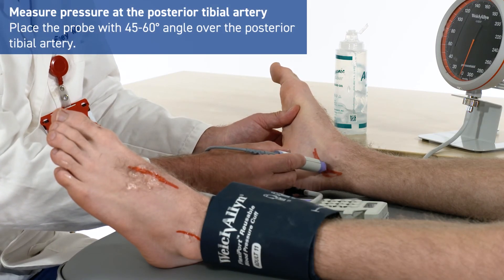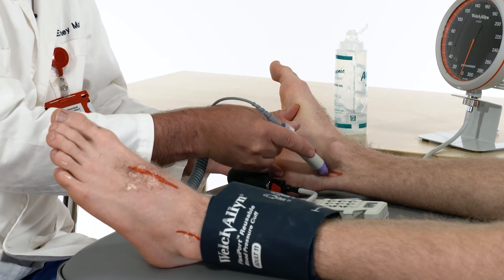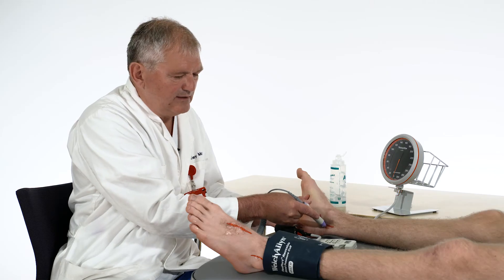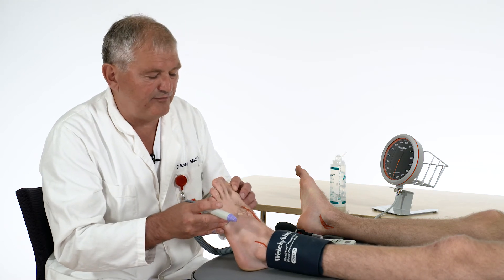After you have measured the pressure at this point, you can go over to the tibial posterior artery. Here again you have to put a small pressure on your probe, still holding it like a pen and supporting with your hand.